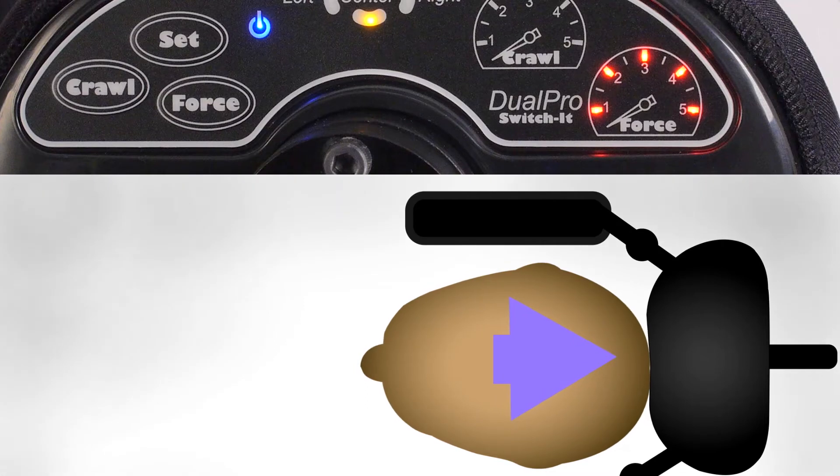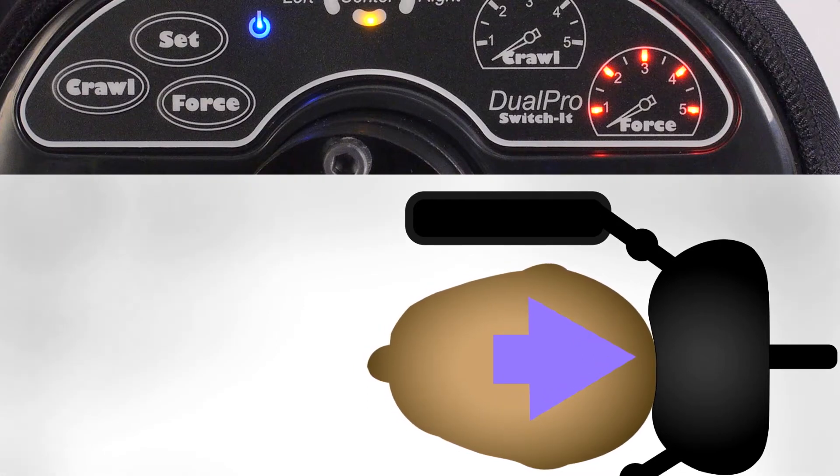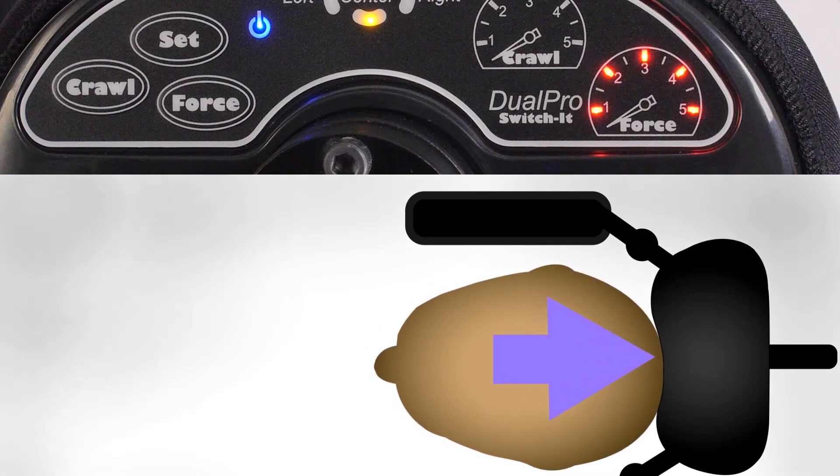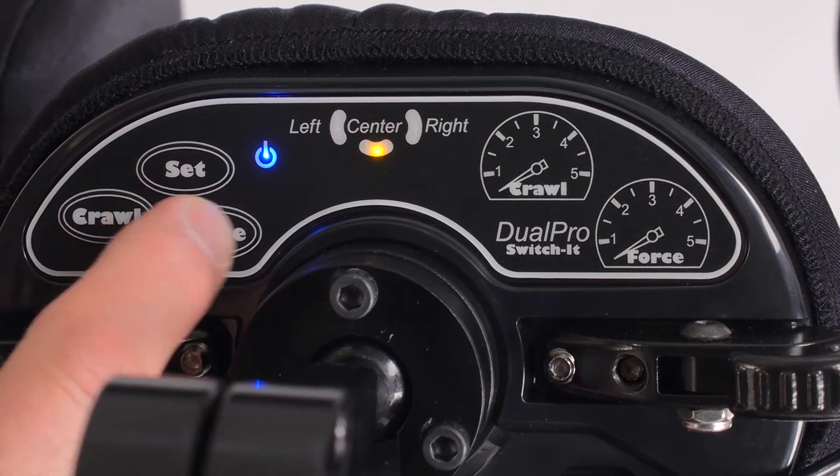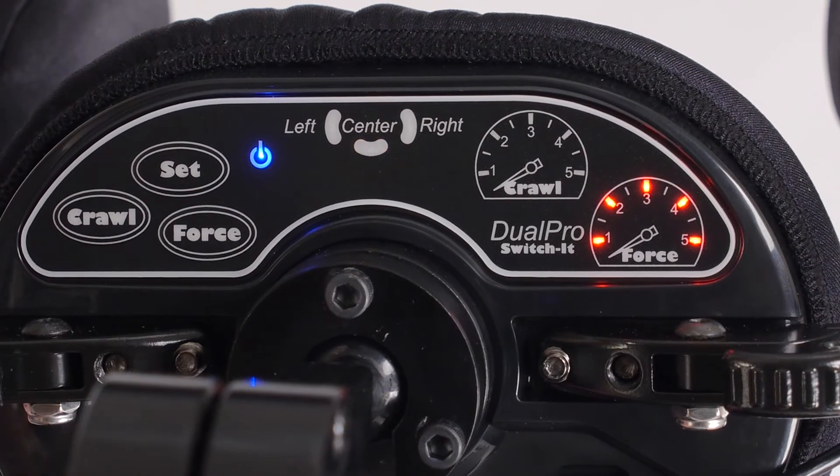The more red lights that are lit, the more force required to reach 100% of the chair's speed. Any one of the three pads can be set to respond to only proximity, only force, or a combination of the two.